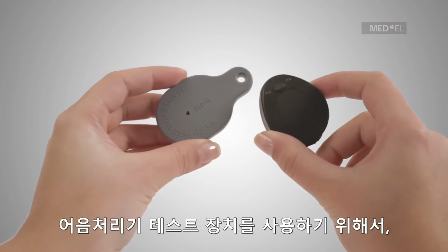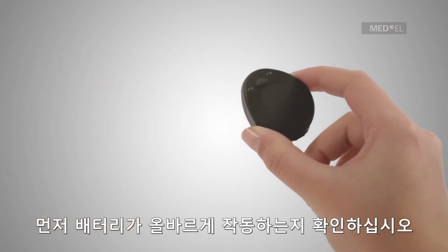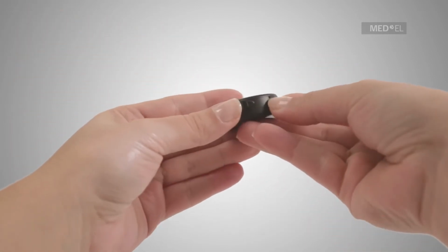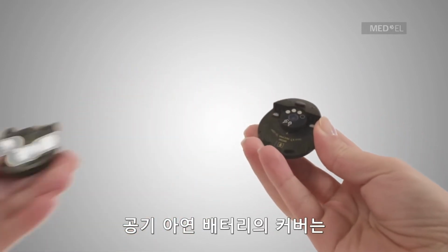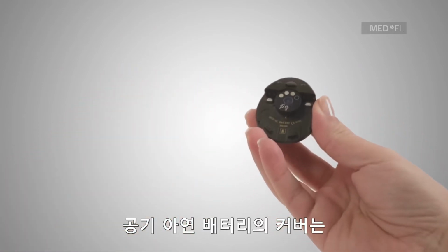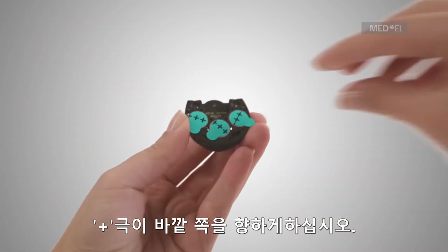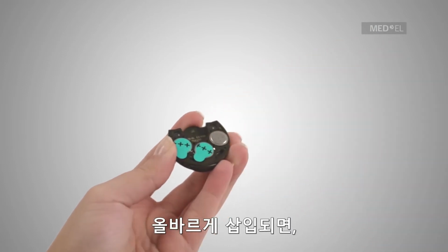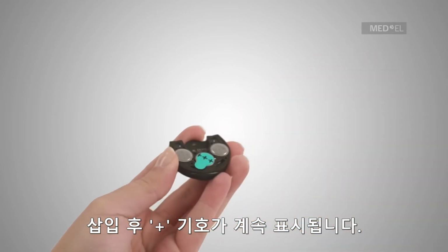To use the speech processor test device, first ensure that the batteries are adequately working. You may wish to test using fresh batteries. The foil covering the zinc air batteries must be removed before use. Ensure that the plus pole is facing outward. When correctly inserted, the plus sign will still be visible after insertion.